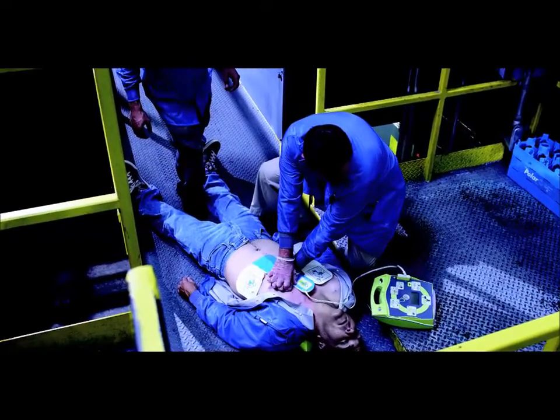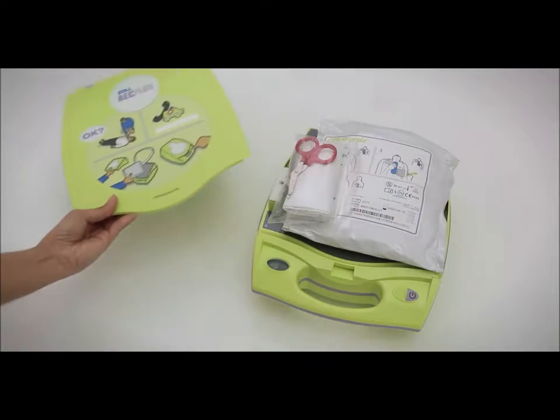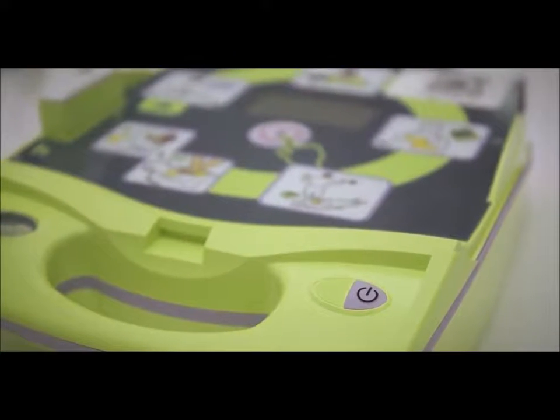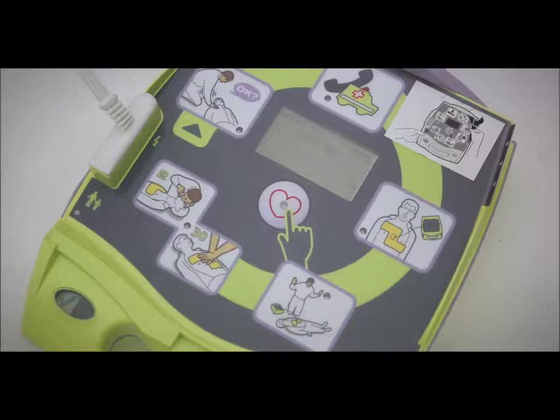During a sudden cardiac arrest, here's what we will do. Once the AED is retrieved and reaches the victim, open the AED's lid. Turn on the AED, following the audio and visual prompts throughout the rescue process. An LED light will indicate what you should be doing. Unit okay. Adult pass. Stay calm. Check responsiveness.